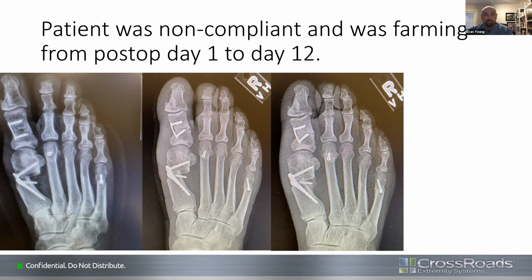I mean, literally within 2 weeks, he'd broken his oblique proximal screw, had significant shortening of the osteotomy, staking of the head there on the lateral cortex with some proximal translation. I think he broke his proximal phalanx with it as well. And you can see we coupled this with a nice Taylor's bunion. It was a dorsiflexory metatarsal osteotomy.